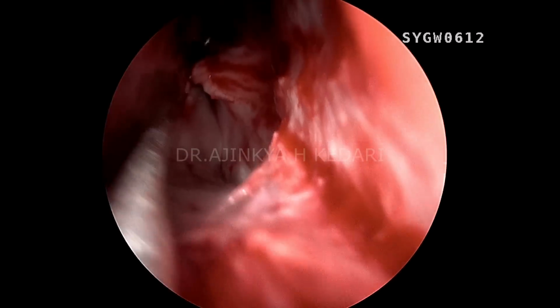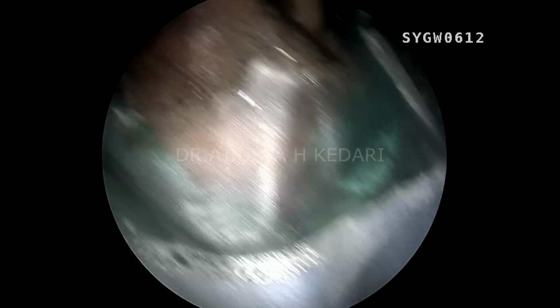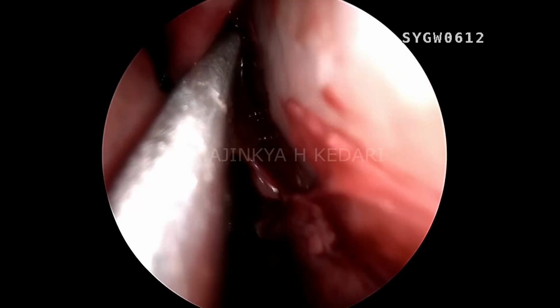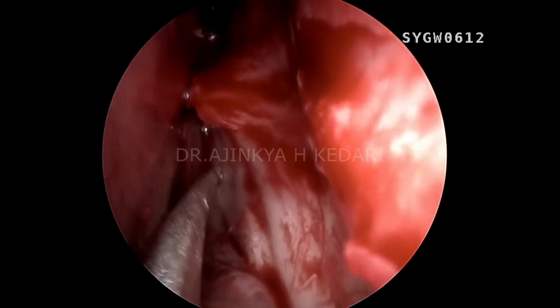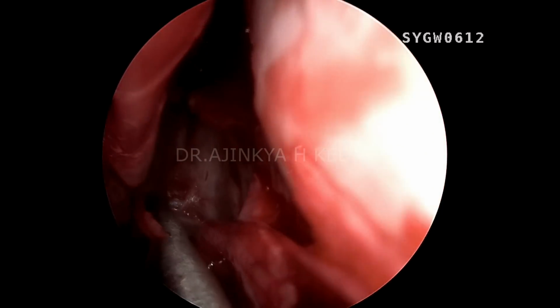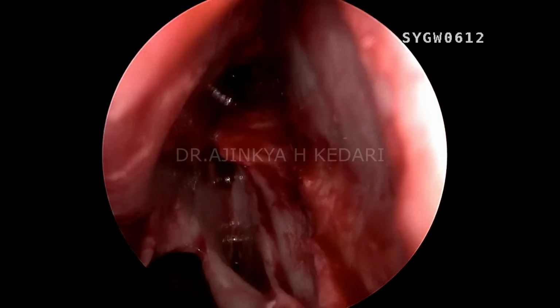That's the posterior most area of the sphenoid ostium. I'm taking the inferior incision with a turbinectomy scissor right now. And so superior incision, inferior incision, a good amount of thick Hadad flap. And then I'll rotate that Hadad flap. You can see that's the inferior incision, and that's the base of the Hadad towards the choana. Make sure you do not damage the posterior septal artery. You can see very gently I'm trying to elevate that.